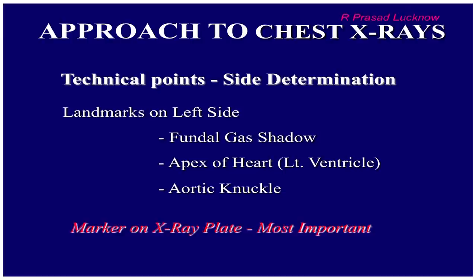Landmarks on the left side include: the fundal gas shadow, the apex of the heart, and the aortic knuckle. Using these three landmarks you can recognize left and right sides of the chest X-ray. However, these landmarks may not always be visible. In that scenario, the sacrosanct marker put by the technician while taking the X-ray is used — so in cases of difficulty, look at the marker to determine left or right.